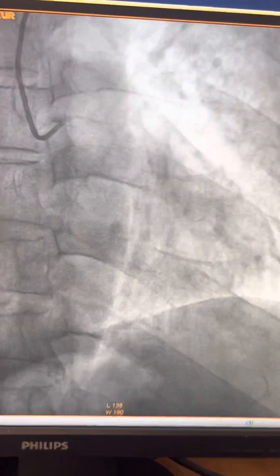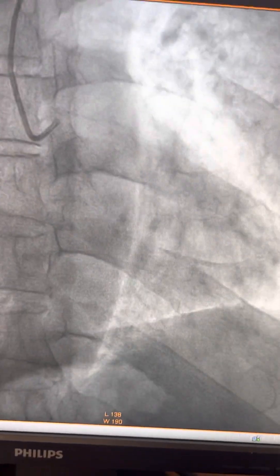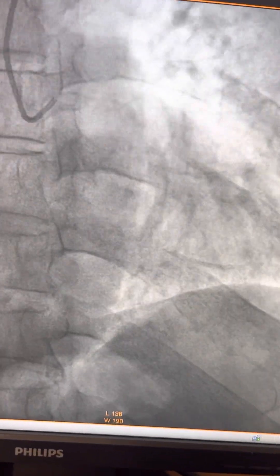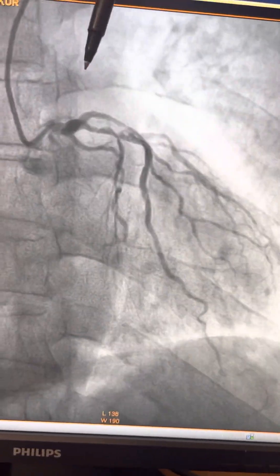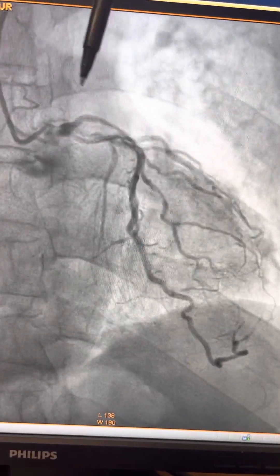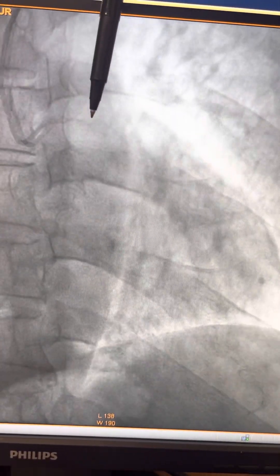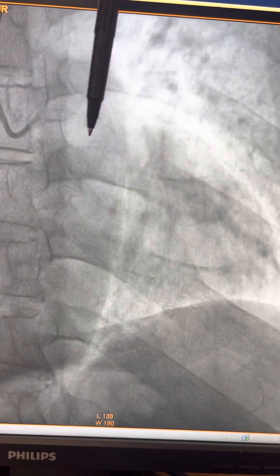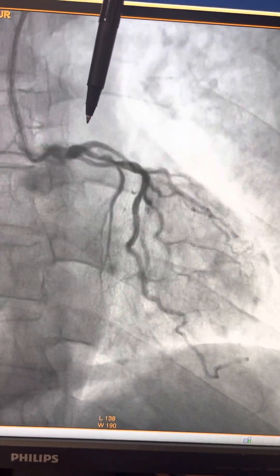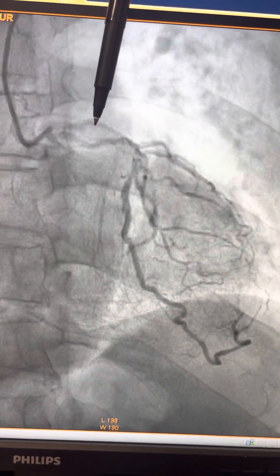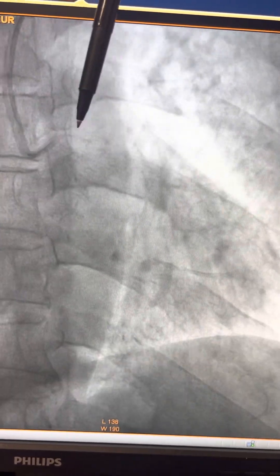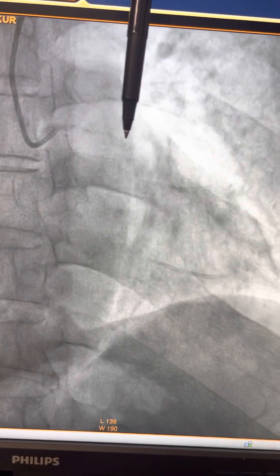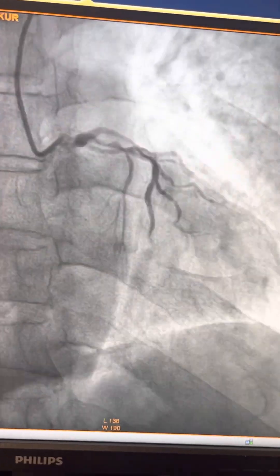This is the angiography of an 80-year-old male. You can see that before the dye comes, there are a lot of these blackish shadows which are present. These blackish shadows are actually calcium deposits.